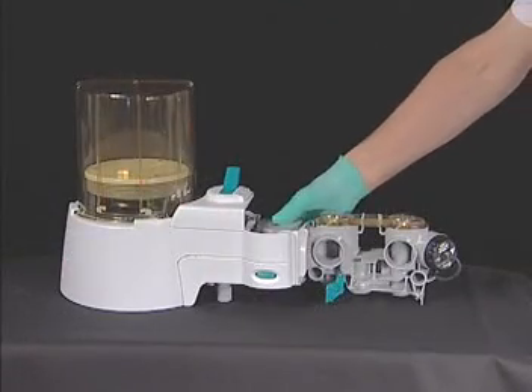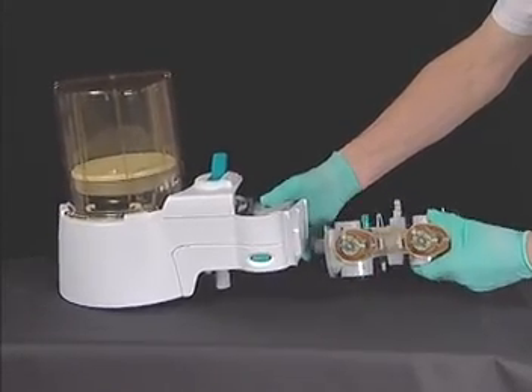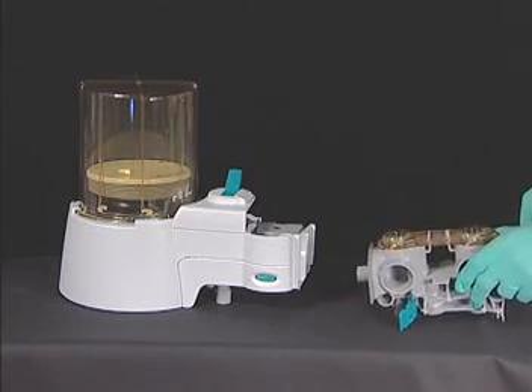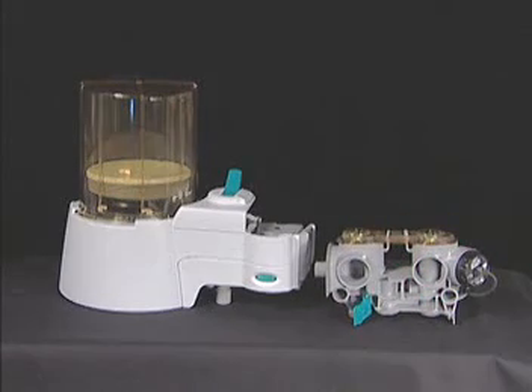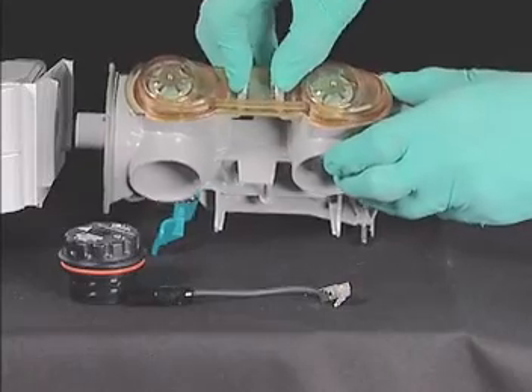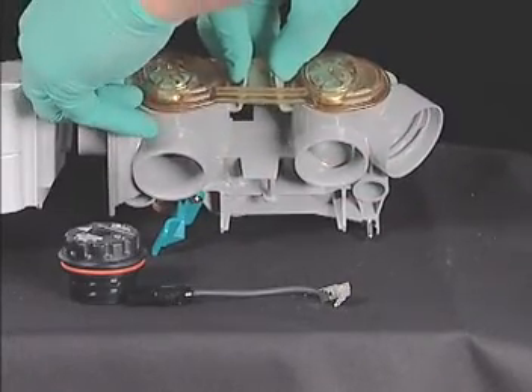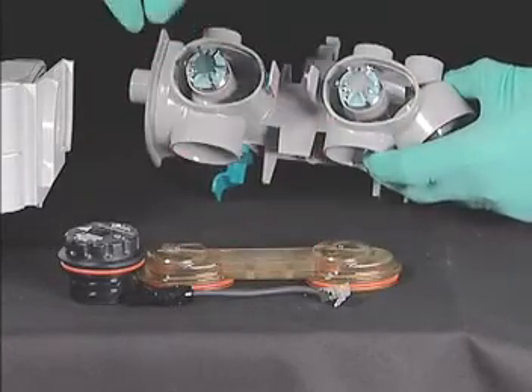Further disassembly of the ABS is possible. Rotate the circuit module counterclockwise while holding the bellows base firmly. The bayonet-style connector is easily released, separating the ABS into two sections. If desired, the inspiratory and expiratory flow check valves can be removed and cleaned by squeezing the two tabs together and pulling up on the check valve cover.